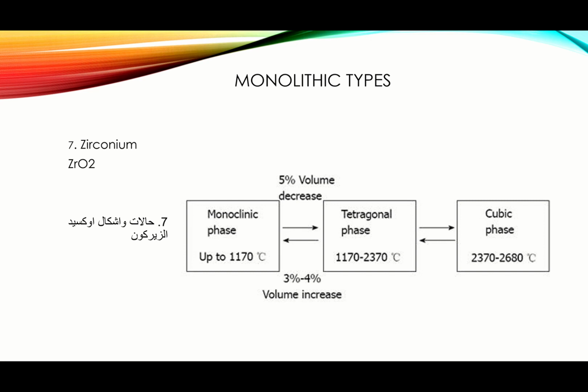So all we're talking about is zirconia. There aren't many kinds of zirconia. It's the one kind of zirconia, called zirconium oxide, that we use, but it has different molecule forms. And based on these different forms, we get different specifications and different physical properties of the zirconium oxide that we use in dentistry.